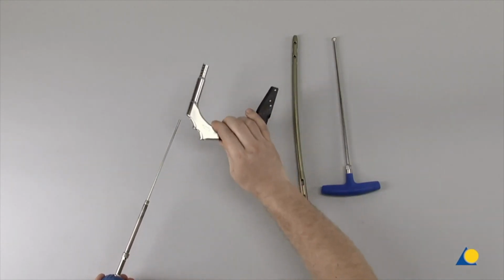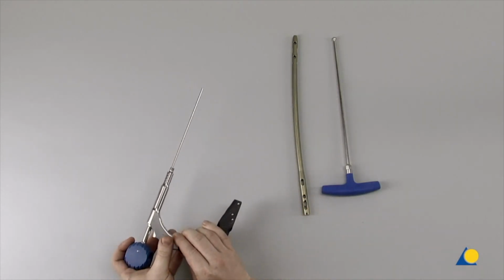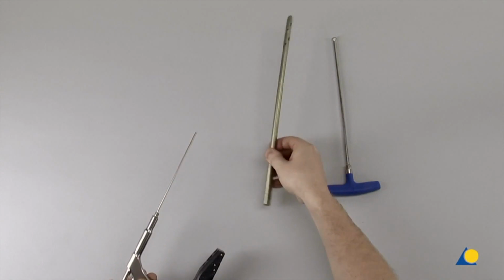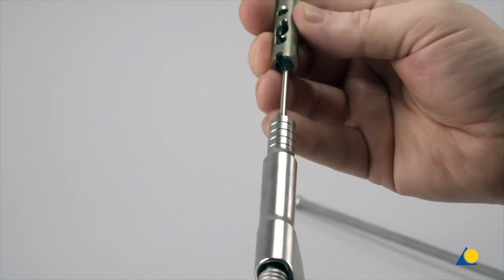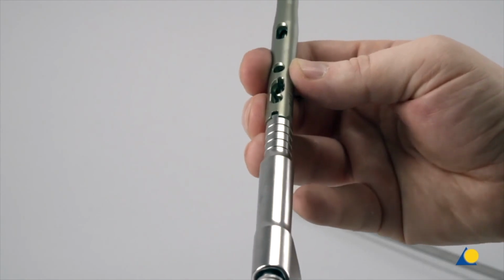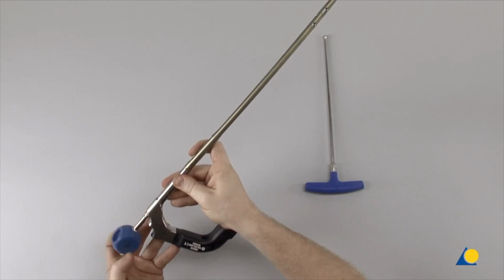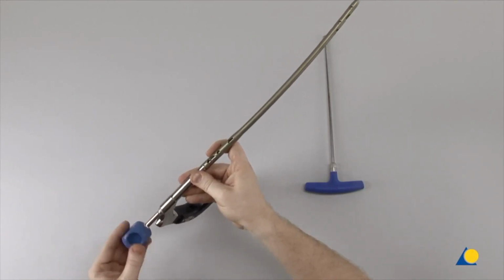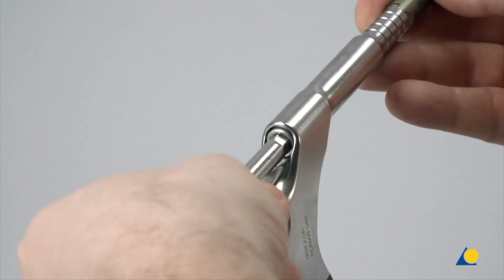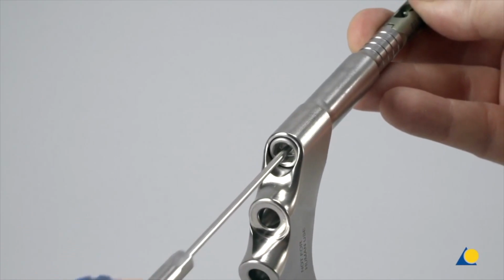followed by the insertion handle. The nail is slid over the assembly and the tang of the handle is matched to the notch of the nail. The rod pusher is turned clockwise until the nail is tightened securely to the connecting screw and the insertion handle. The rod pusher is removed.